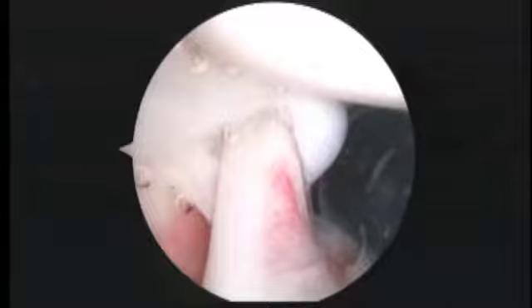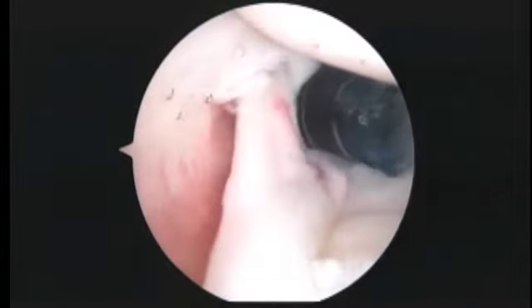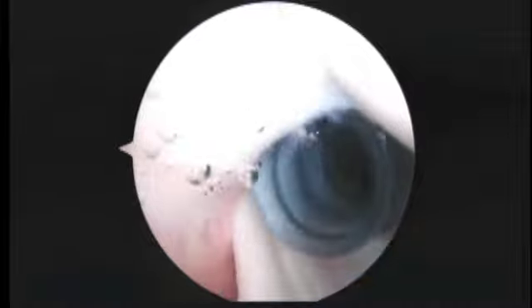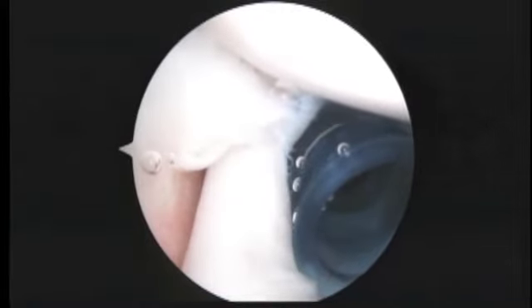Pause, please. Okay, so we're looking from the back to the front. This area where slap lesions happen is fine. Your biceps tendon is inserting into the labrum normally. That little area I was concerned about is really just part of the biceps sheath. So you have a little bit of extra tissue around the biceps, and that's normal. We don't need to do anything significant with that.